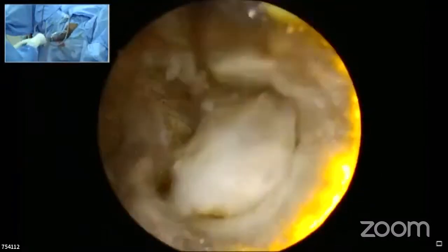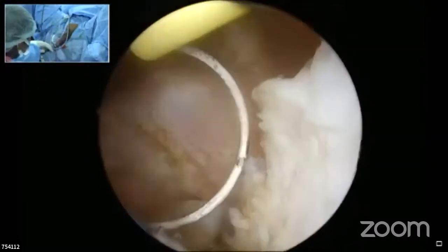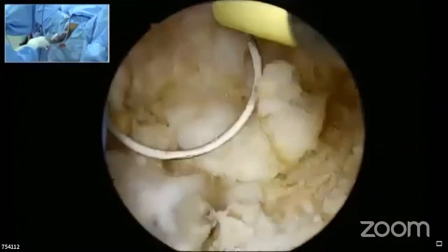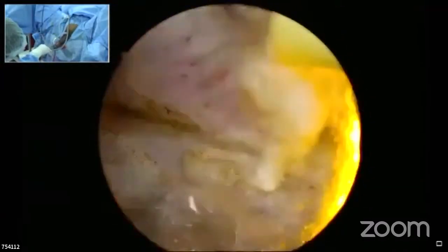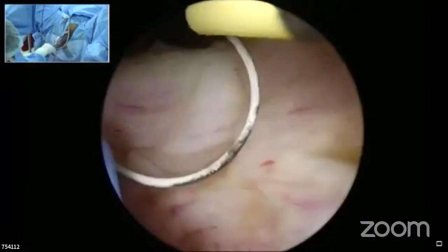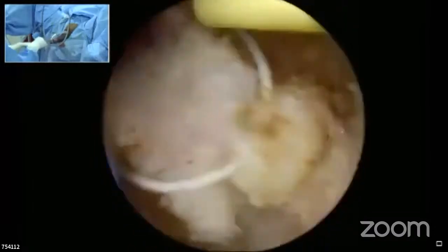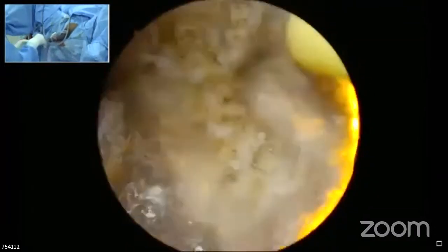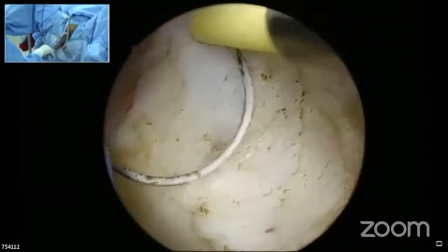So Olympus cutting, as you are mentioning, is very good, but coagulation is not very good. There is more bleeding. And this system is new actually; wherever I have worked, I got only Storz, so I'm more happy with the Storz system. But it is up to your habit, whatever you want to use. Ultimately, it appears that it's what we get used to.